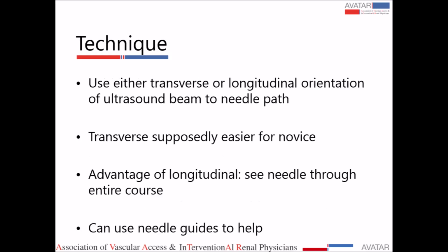What is recommended is real-time insertion guided by the ultrasound, in which you can actually see the needle tip entering the vein, and this prevents mechanical complications. You can use either a transverse or longitudinal orientation of the ultrasound probe. I have shown you both, but because the transverse gives a better view of the needle entering the vein, it is initially preferable, especially for novice clinicians. We can also use the needle guides on the ultrasound machine, which give the direction of the needle entrance.